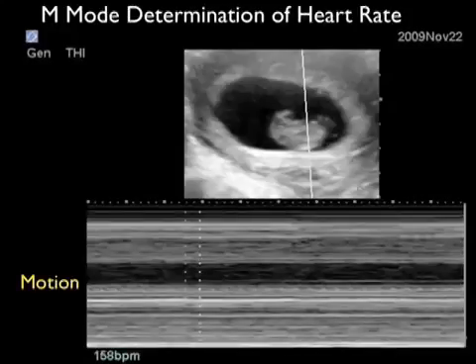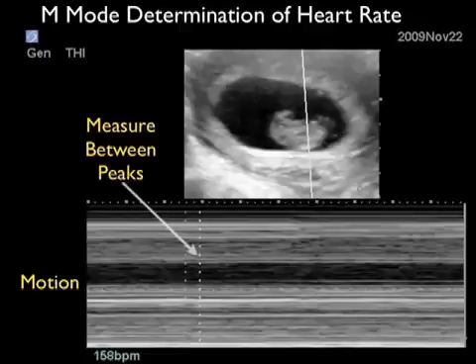Here we're going to use M-mode to determine the fetal heart rate. Notice we have the fetus zoomed up towards the top of the image, and we're placing the M-mode caliper directly over the fetal heart. Towards the bottom, we see the M-mode motion strip, and notice the little waves showing the motion of the fetal heart. In this particular ultrasound machine, we need to measure between each peak, and we can see here that we get a heart rate determination towards the bottom, 158 beats per minute. This is something we can print out and place on the chart to show that at the time we saw the baby, there was an actual heartbeat.